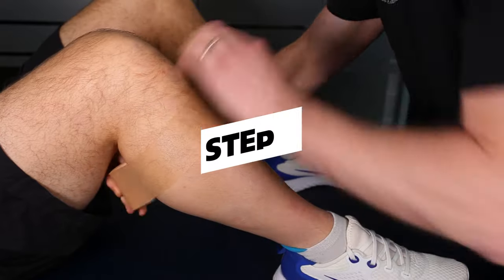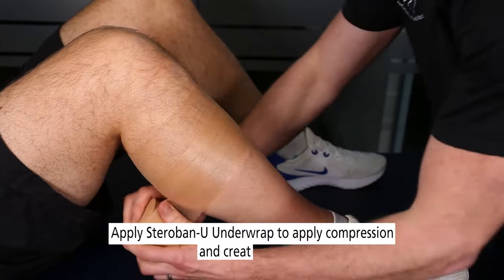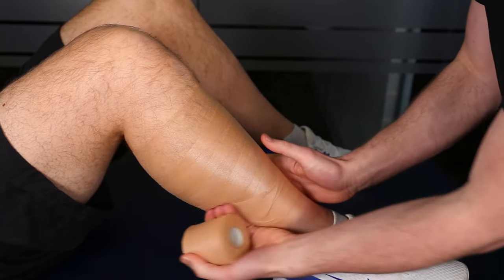We're going to apply this underwrap, which is going to create a little bit of compression for us as well, just to make sure that we cover the area that we're working on. This is to reduce the risk of ice burn and create a barrier between the skin and the ice pack.